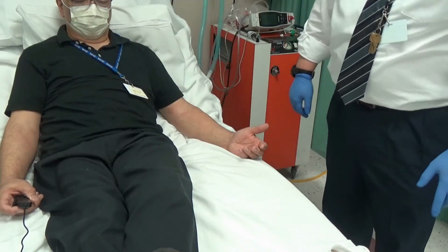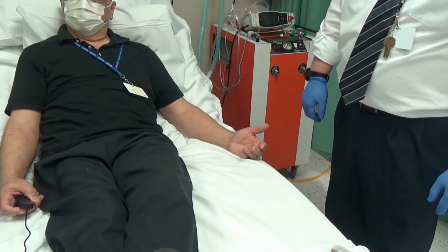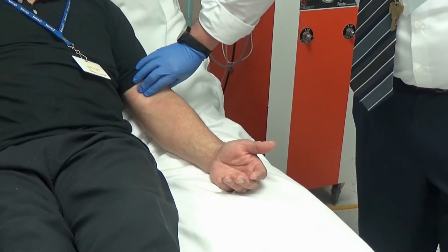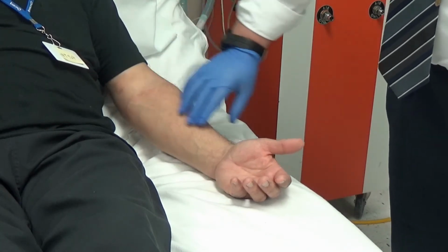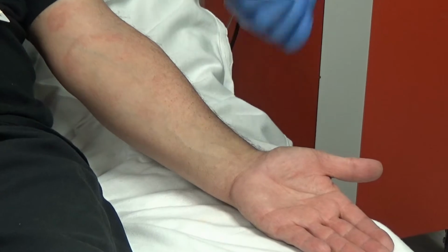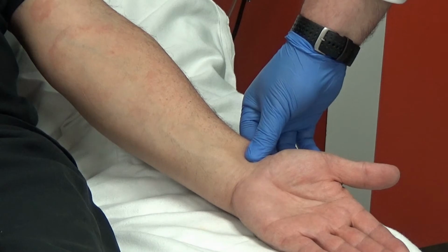Then we get into putting the pulse ox on the patient's finger and checking our vital signs. Now that we have the pertinent information from the patient, we're going to check for our pulse. Whenever you're checking for a pulse, typically you're going to use the radial pulse, or you could use the brachial pulse. Whenever you're checking blood pressure, you're always going to look for a brachial pulse. When we're just checking for a pulse, we usually look for a radial pulse. You just use your index finger and your middle finger. You don't ever want to use your thumb because you actually have a pulse in your thumb, and you may feel your own pulse rather than the patient's.